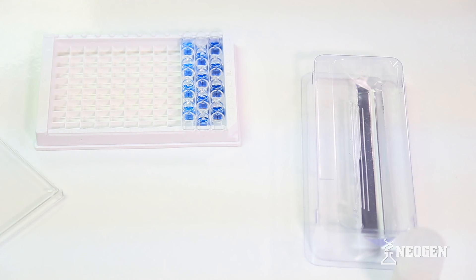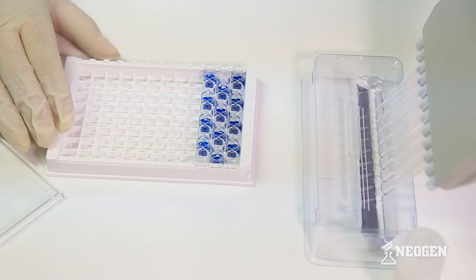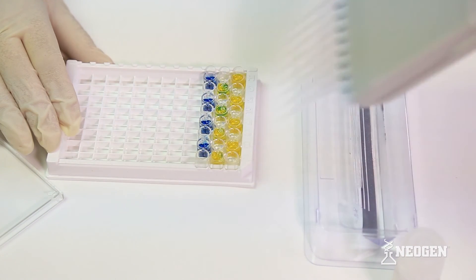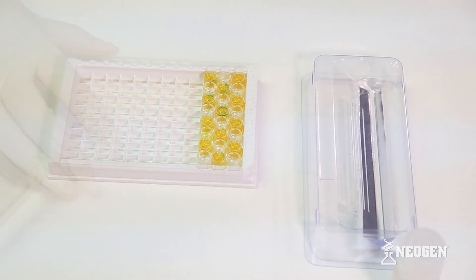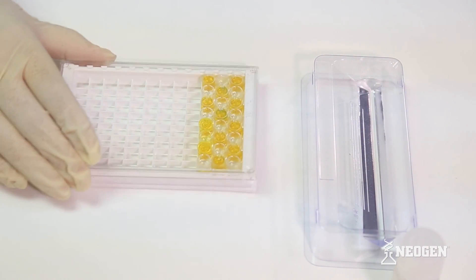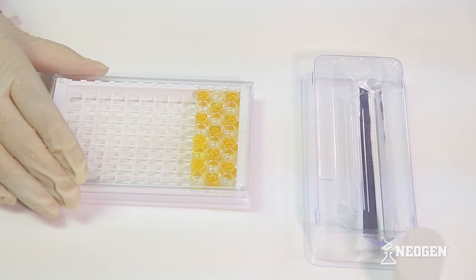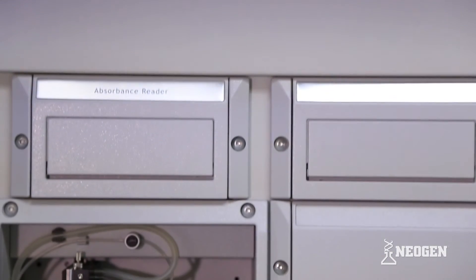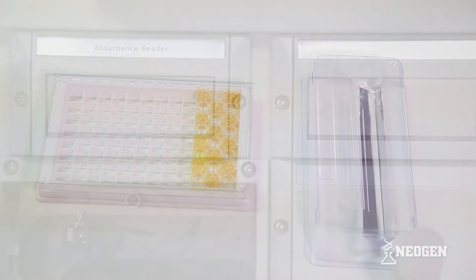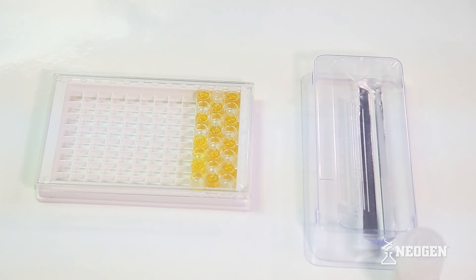When 30 minutes has elapsed, use a multi-channel pipette to add acid stop to each well to stop the reaction. Mix the plate gently for a few seconds and read the plate at 450 nanometers. Results are inversely proportional. The absence of drug in the sample will result in strong color development, whereas the presence of drug will result in decreased or no color development.